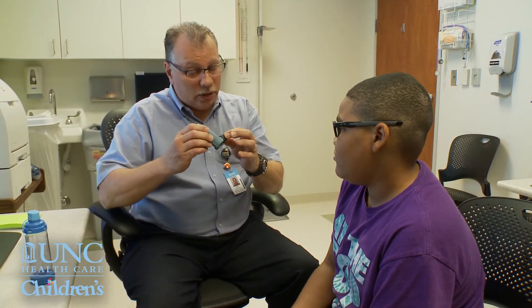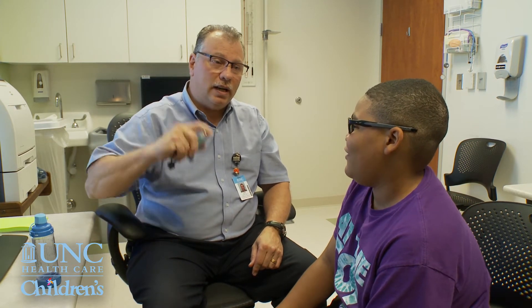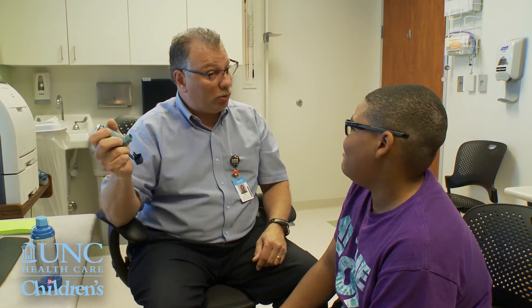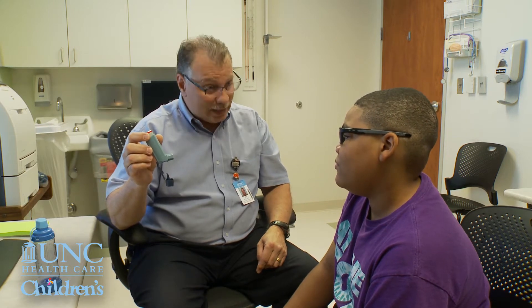So the first thing you're going to do when you get this from the pharmacy is you're going to take it out of the package, open it up, and shake it for five seconds — 1,001, 1,002, 1,003, 1,004, 1,005 — and spray it out in the air just like that. That's called priming. For Ventolin, you're going to prime it four times.